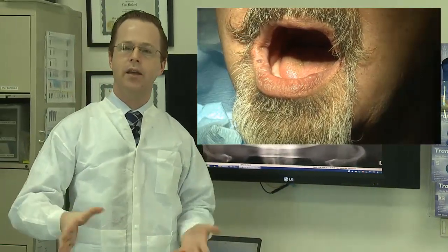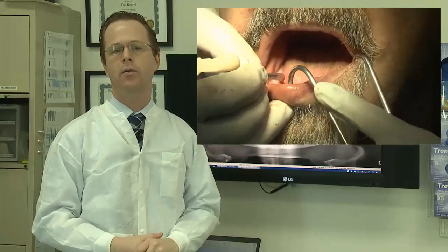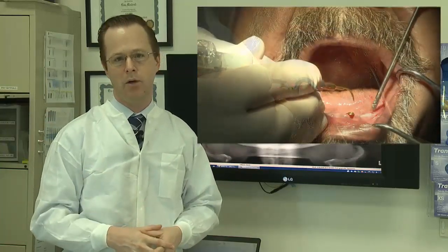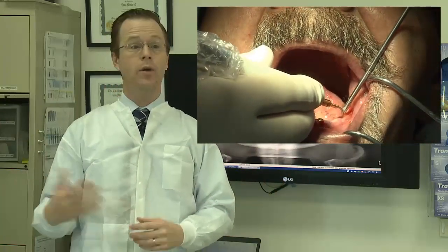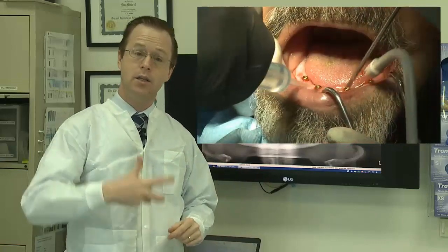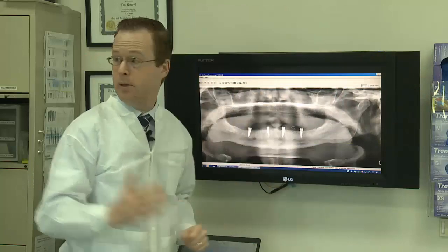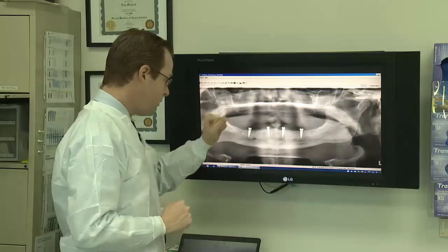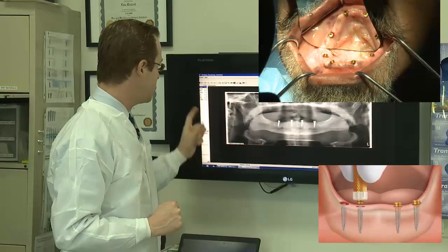Dr. Engel and I worked on the case using a piezo and a surgical curette to remove some bone spicules. Working with our dental assistants and dental students, we noticed there were bony spicules floating in the socket, so we flushed those out really well with a couple of back and forths. Ultimately, we seated those locator abutments and here is our final X-ray.